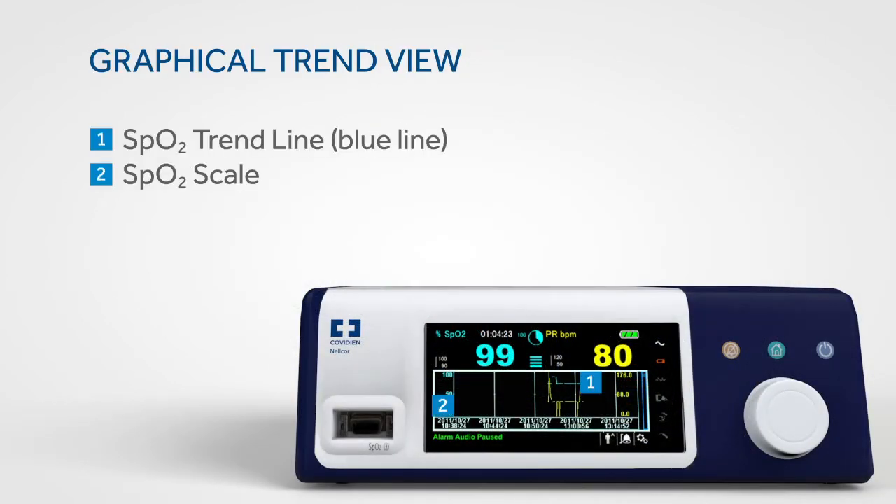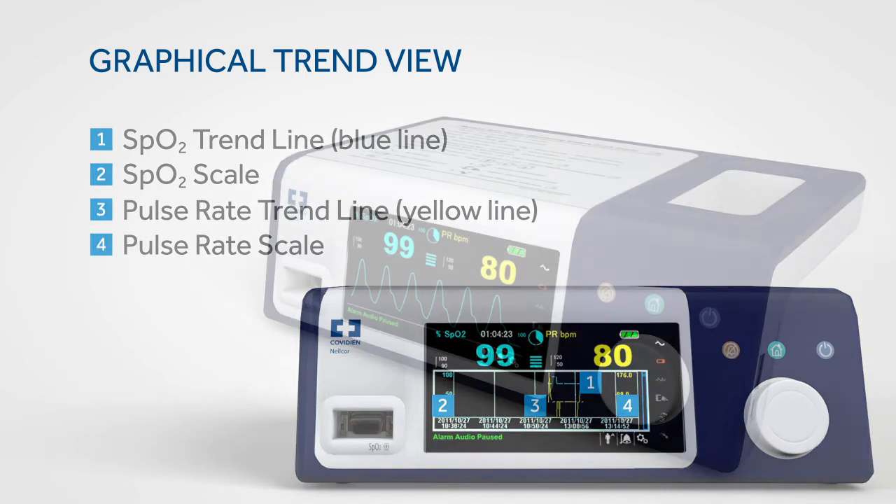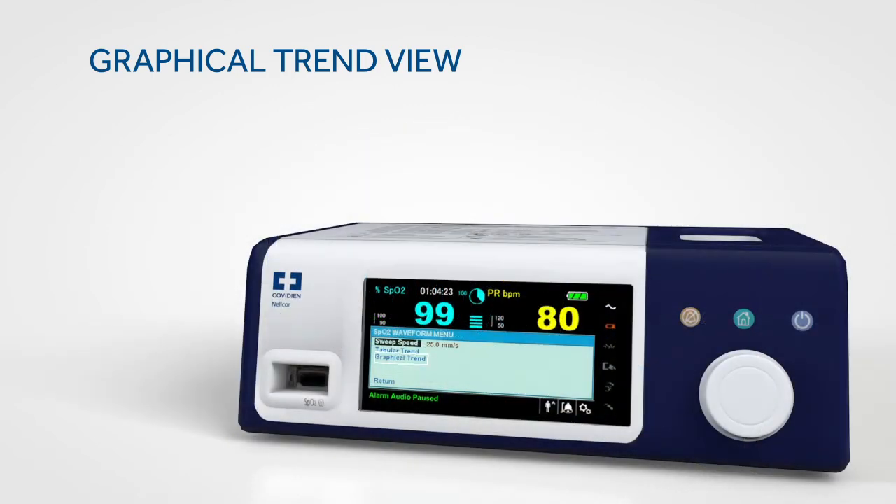The monitoring system presents trend information in a single graph for all monitored parameters when you enable this option. To access the graphical trend view, rotate the jog dial to highlight the waveform or trend display area and press, then select graphical trend and press again.